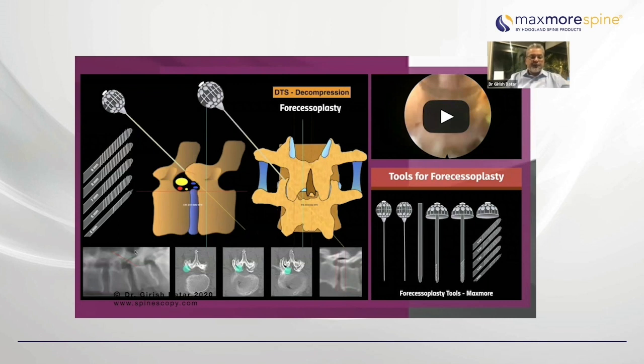So when you do this, the amount of bone that you take off from the roof, that is the lamina part of the superior articular process, the part of the vertebral body which is probably the end plate osteophytes from the end plate of the inferior vertebra, and the medial wall of the pedicle, all needs to be taken out.